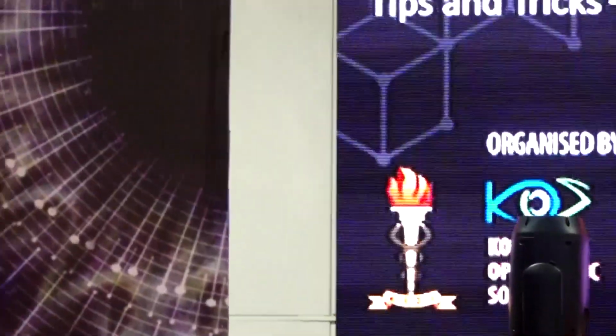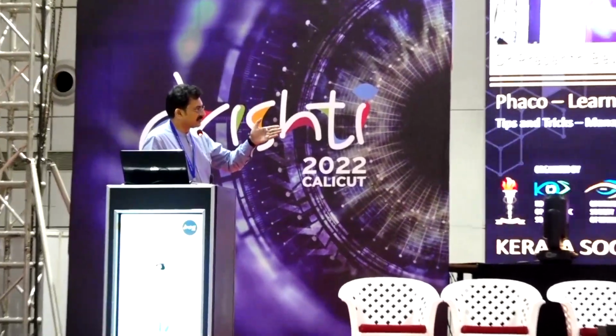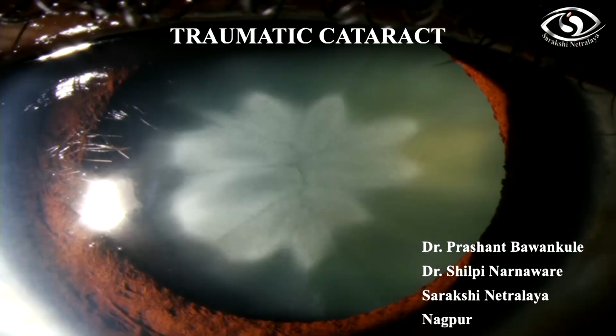I told you, that's very common, that the trailing haptics will get stuck 100%. I saw many videos last time in Paris and Vienna, they have shown a lot of things, 10 videos, in all of them they broke it. There's no need to worry. Just stop it, take a blade, side port, cut the cartridge vertically, in 1 or 2 places. Then you pull it. First we have to release the compression forces between the silicon and the cartridge. Then once you release it, I think Dr. Prashant is ready, no?